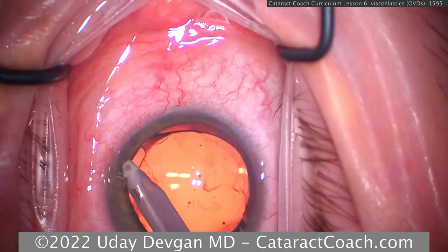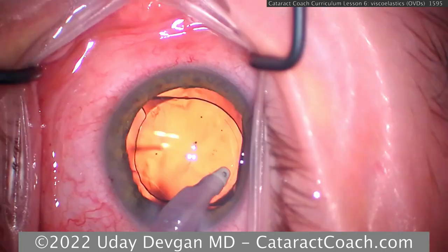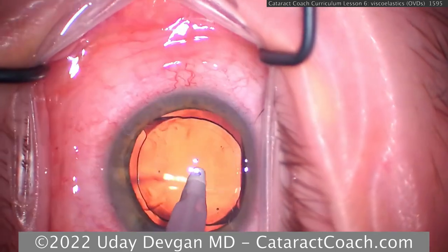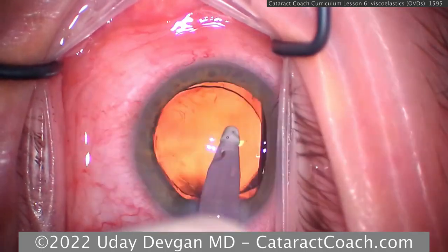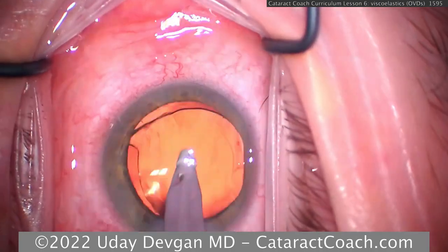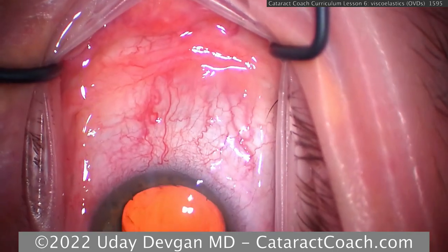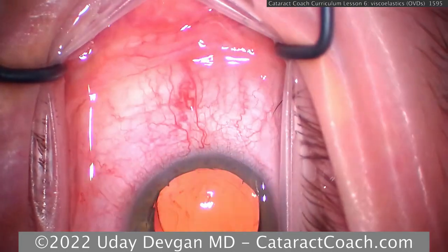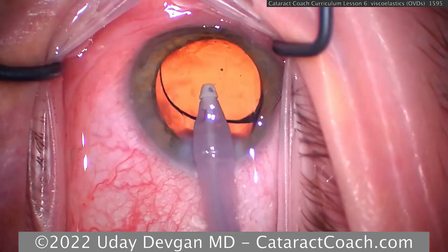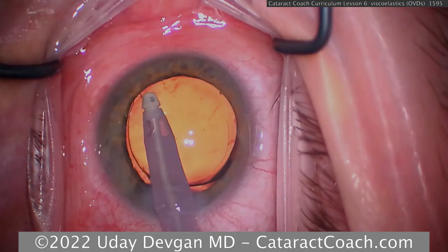Use a high flow and high vacuum setting on your IA machine. So again, important to lift the IOL optic up towards the corneal apex. That's the correct maneuver. Don't just shove the IOL towards the capsular bag equator. You want to have a proper technique here. So my opinion is, if you're just starting off, first 100 cases, don't worry too much about it. You're probably just doing monofocal IOLs anyway. But certainly, you do need to progress to the point where you are going behind the IOL to fully remove viscoelastic. It'll give your patients the best results.